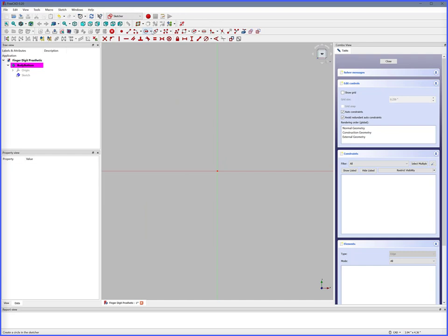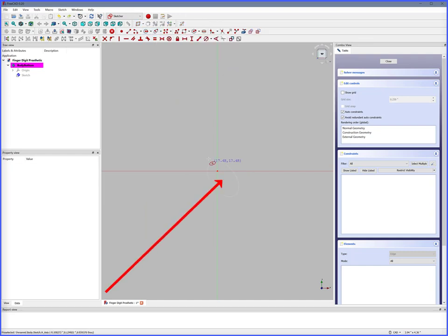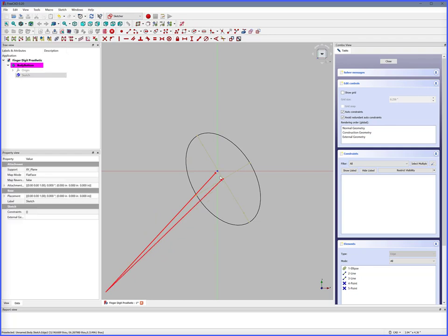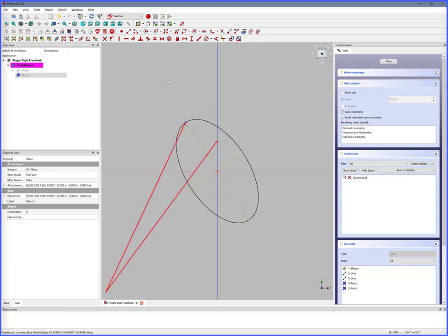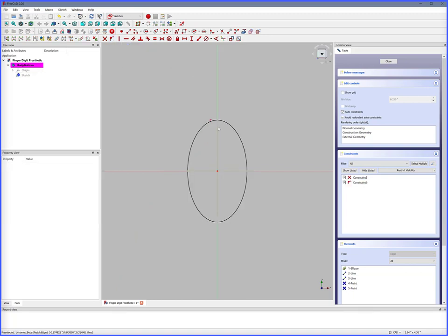First we'll create the cylinder outside dimensions. Ellipse by center, click, double click to complete, right click to release. Select the XY axis center, select center of ellipse, Constrain Coincident — it is now centered. Select ellipse point, select the Y axis, Constrain Point Onto Object — now it is symmetrical.